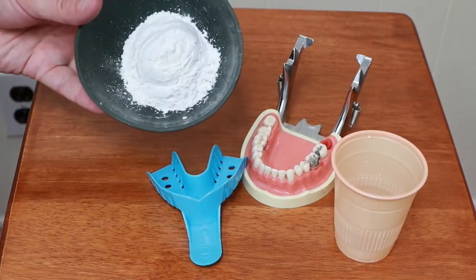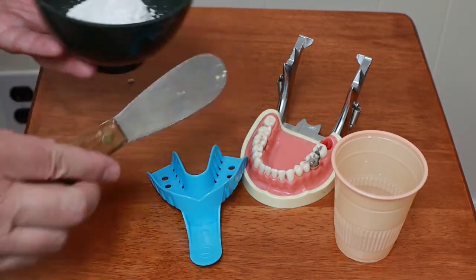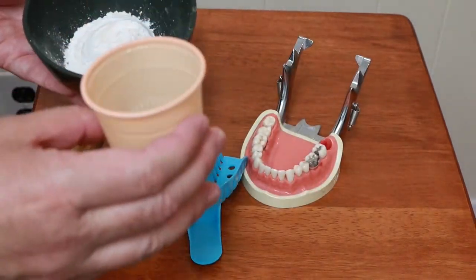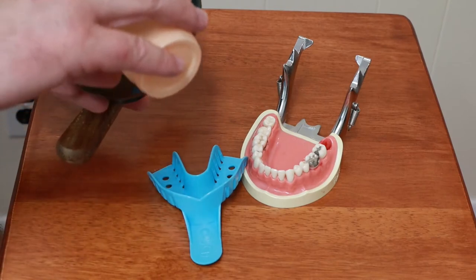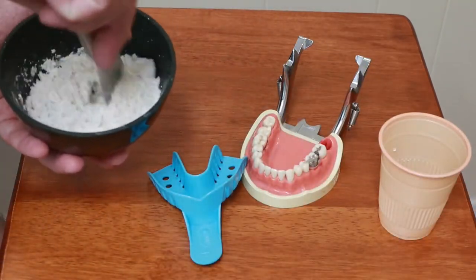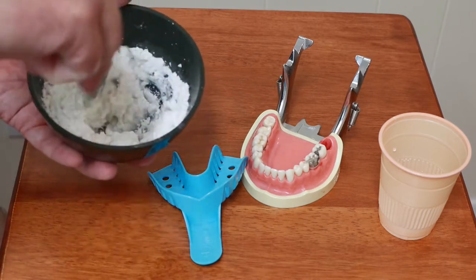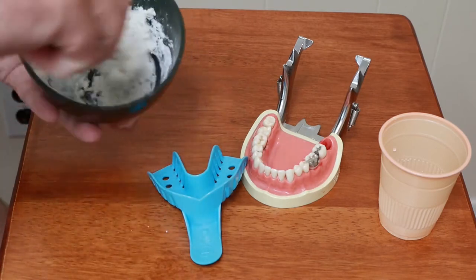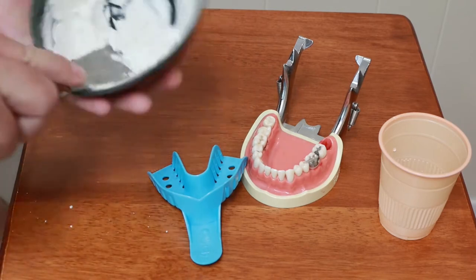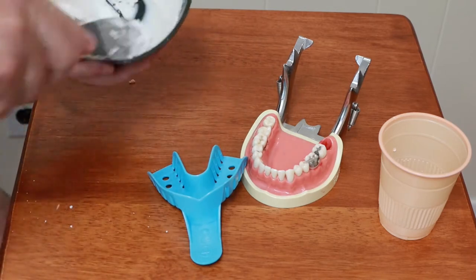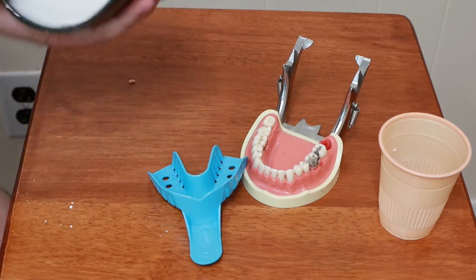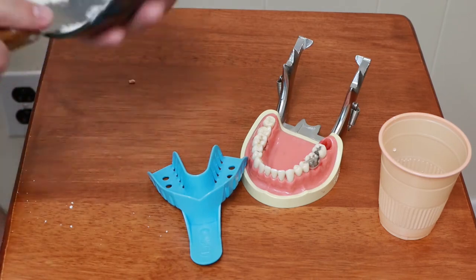The alginate material is just a powder that you mix up. This is a pre-measured amount of water that goes with the three scoops of powder that I have in here. Add the water to the powder, just mix it up. Get it nice and creamy. Make sure all the powder is incorporated into the mix. Smush it against the edge of the bowl to force any air bubbles out of the mix.